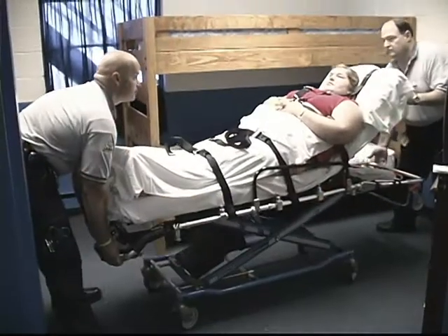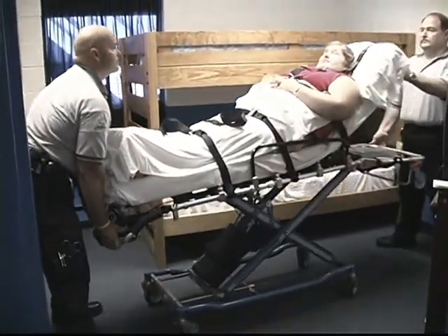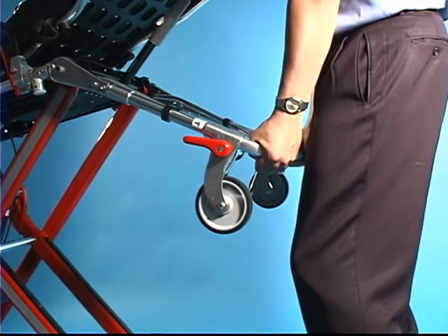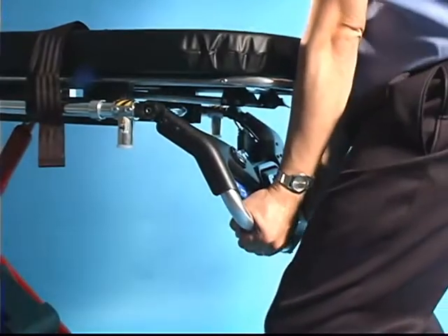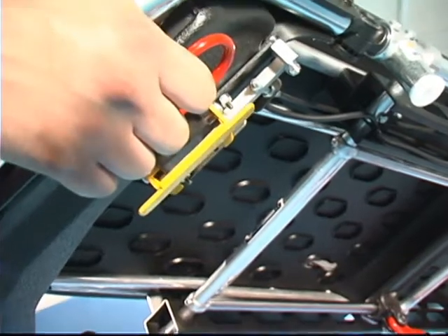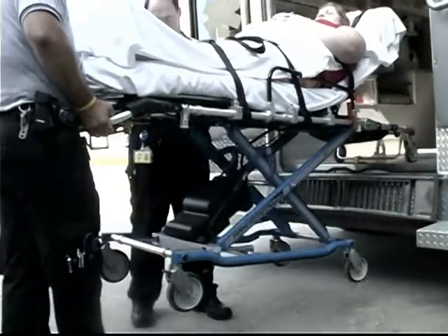To raise or lower the cot, both operators stand at opposite ends of the cot and use an underhand grip to grasp the main frame. Shorter operators can lower the drop frame and foot and lift frame for better leverage. The PowerFlex includes a manual release handle to operate the cot in manual mode if needed. Consult the manual for guidelines on the proper use of the cot in manual mode.